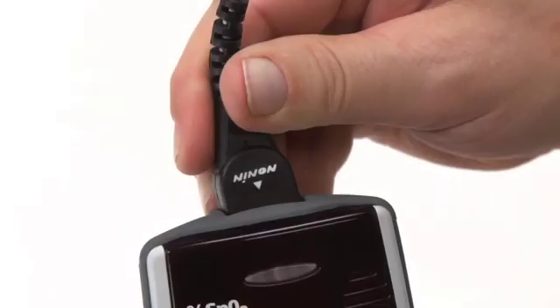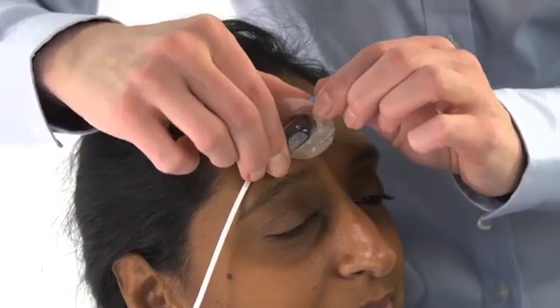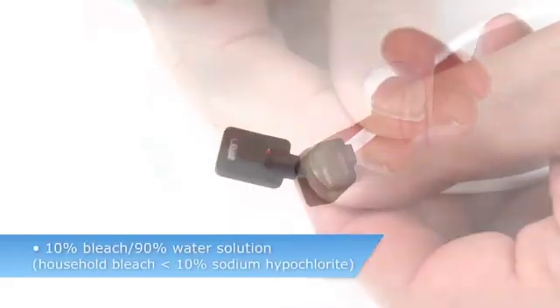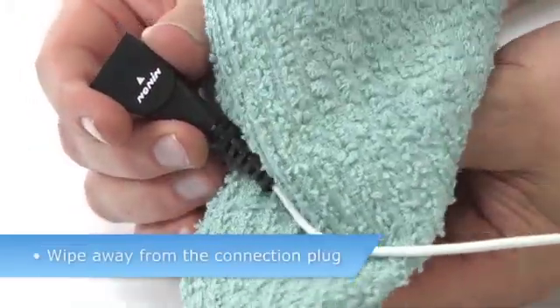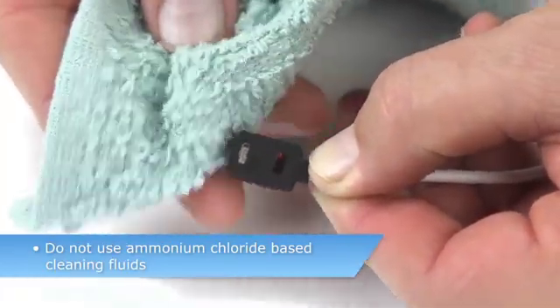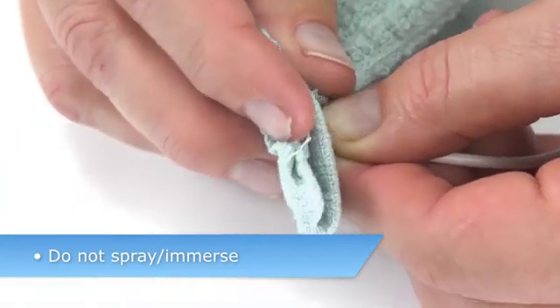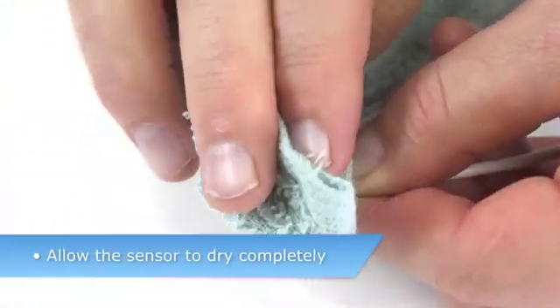To clean the sensor between patients, unplug the sensor from the oximeter. Remove and discard the holder and wipe the skin contact surface of the sensor with a soft cloth dampened with isopropyl alcohol or a mild detergent. Then wipe away from the plug on the cable toward the sensor. Do not use caustic or ammonium chloride-based cleaners or spray or immerse the sensor, which may damage the sensor elements. Allow the sensor to completely dry before the next application.